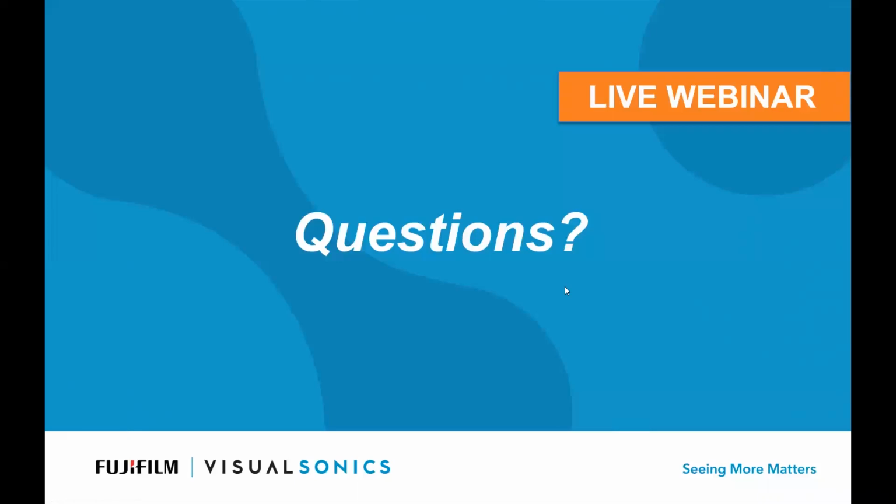Have there been any changes to the Vevo HD algorithms? No, not with this version. There was a substantial change to Vevo HD about 1 or 2 major versions ago, where we redid some of the speckle reduction and also extended Vevo HD to include spatial compounding selectively in certain situations. But that was a couple of versions ago. So no, with 3.2, there's no major changes there.